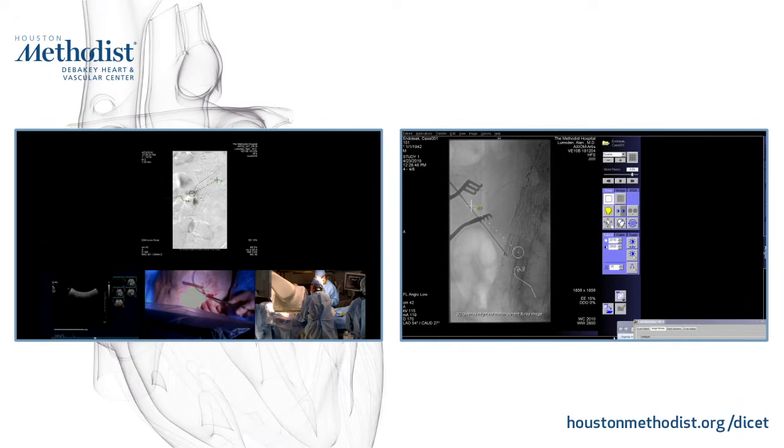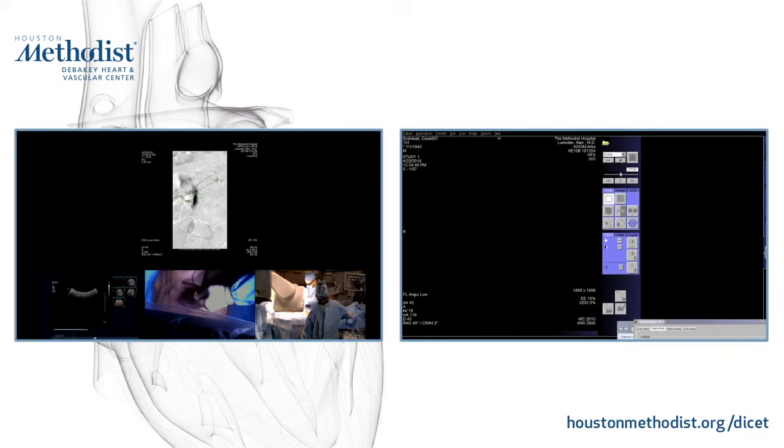And those are the two arteries that we looked at on the dynamic CT scan. Exactly. And you can see both of them very well in our angiogram. This is our inflow and this is our possible outflow. And again, the fusion process is something that needs a learning curve, but here we have a great fiducial of the stent graft, which helps us use it much more accurately. So now in this image, we are going to see how we ended up treating this patient.